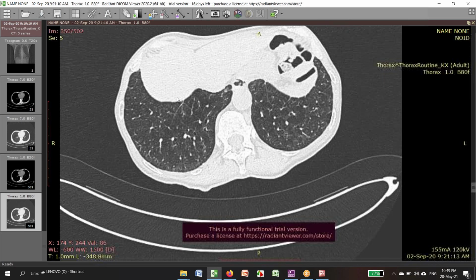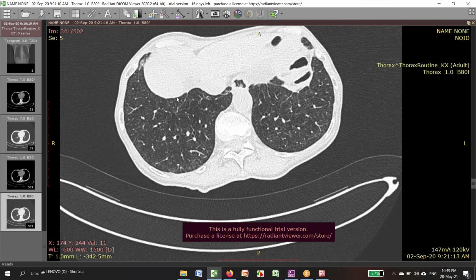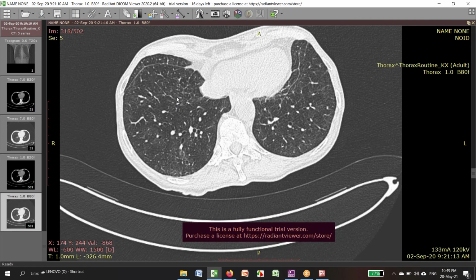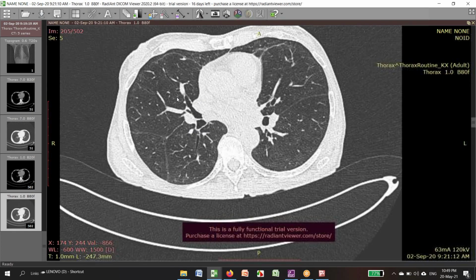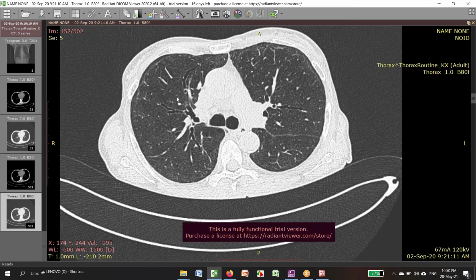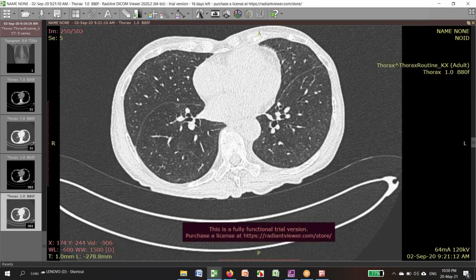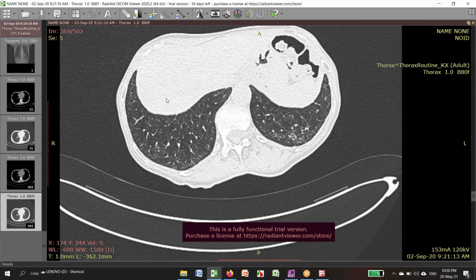And I would also like to highlight with this case that because there is a lot of hype about the post-COVID fibrosis, because actually I think that it's mainly organized pneumonia, we must be really careful about calling it fibrosis. Because as in this case, the improvement can be pretty dramatic. And those that were described as bronchiectasis, and to tell you the truth, if I didn't have the last CT, I would call them bronchiectasis. Actually, they were bronchial dilation because they were reversible. So what do you think?